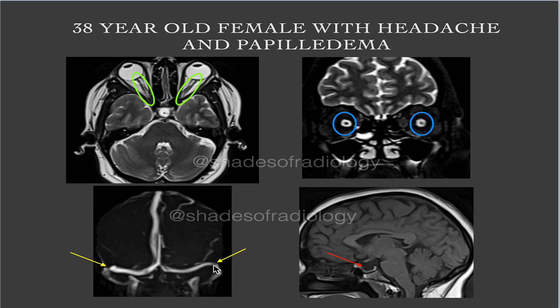You can see the narrowing, which is a typical finding, and you can see the empty sella. Presence of empty sella, prominent dilated tortuous optic nerves with dilated subarachnoid space, and bilateral transverse sinus narrowing — all these features suggest benign intracranial hypertension. There was no other mass lesion in the brain parenchyma or posterior fossa. This is a classic case of benign intracranial hypertension.